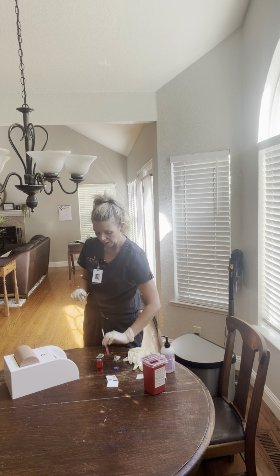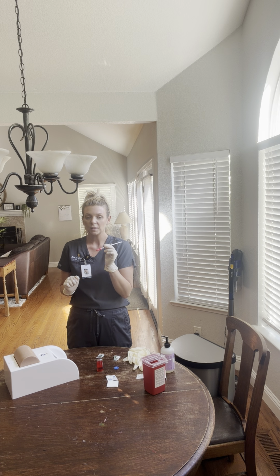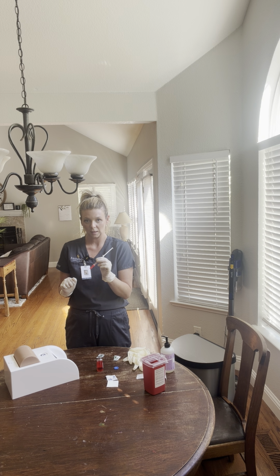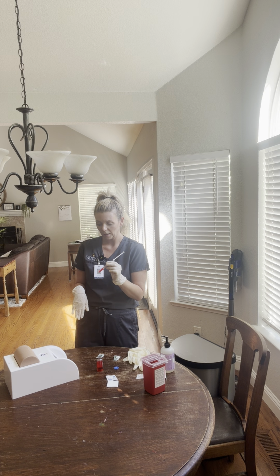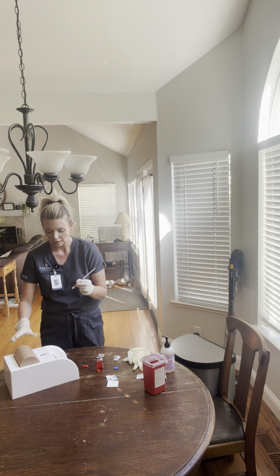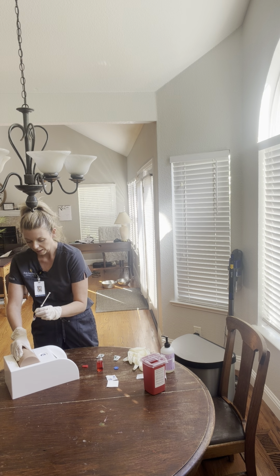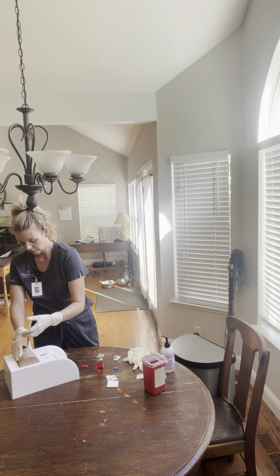I'm going to take my syringe and I'm going to hold it like a dart with my dominant hand. This injection is going to go in at a 45 to 90 degree angle while I'm pinching the skin, and it needs to be administered in a 30-second time period. So my patient is air dried. I'm going to uncap my needle. I'm going to pinch my skin and I'm going to stick that in just like so and slowly inject the heparin into my patient.